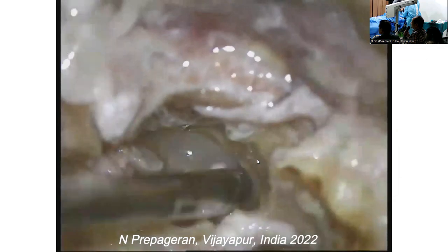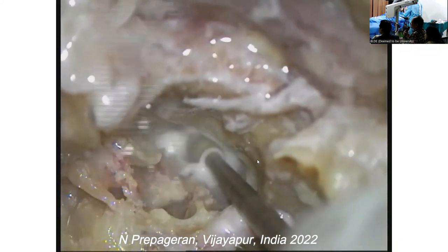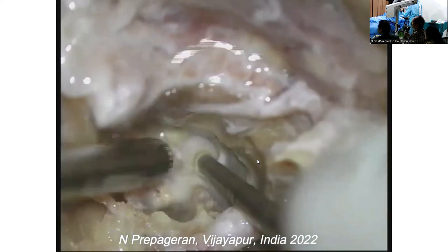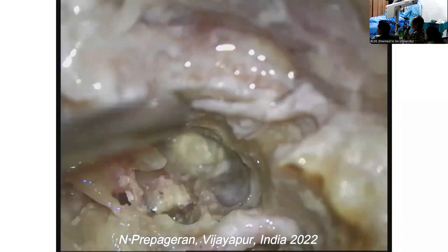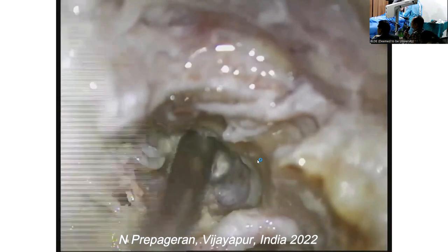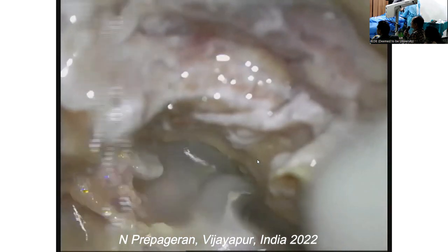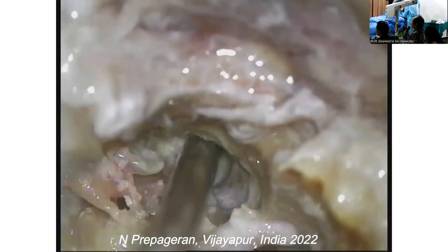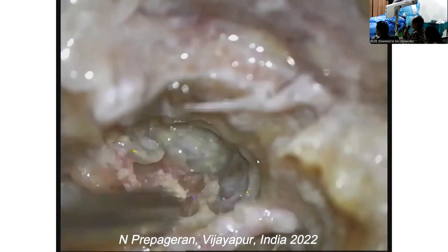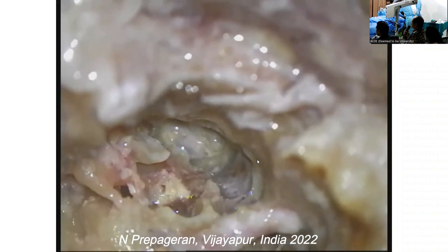Below that, there will be a perifacial cell. Hey guys, that's what you have to go inside for the cochlear implantation. This is beautifully demonstrated here. I have not touched the cochlea at all, so the cochlea is still intact. That's your artery. Let me fine focus. So you can see how the carotid artery turns, comes up, turns at the hypotympanum, and turns like that.